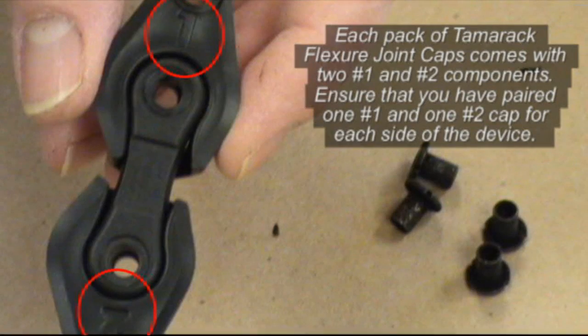Each Tamarack Flexure Joint Caps package includes two number 1 caps and two number 2 caps, as indicated on the back side of the assemblies. You will use one of each number on the medial and lateral aspects of the brace.